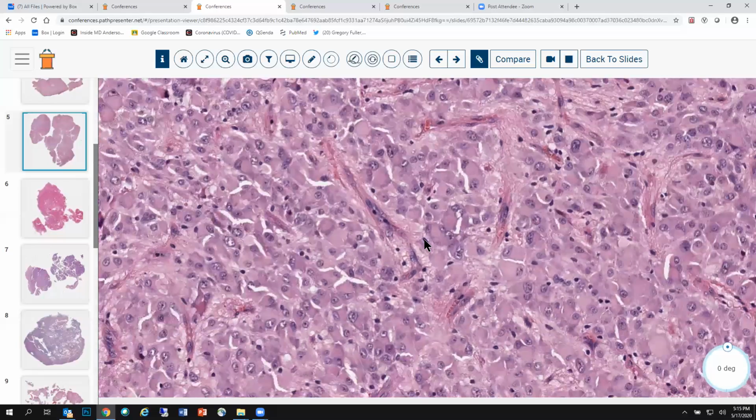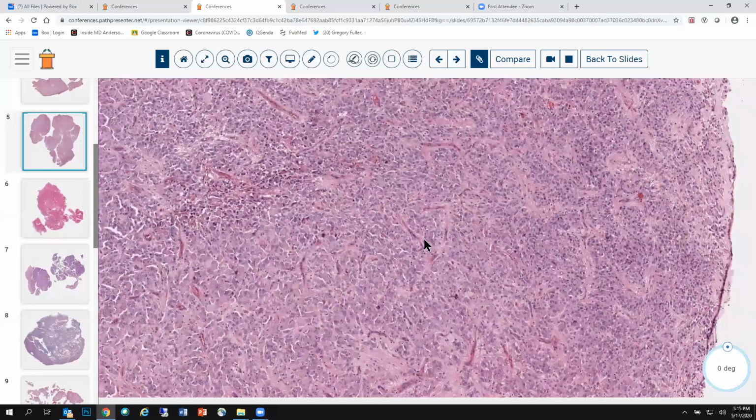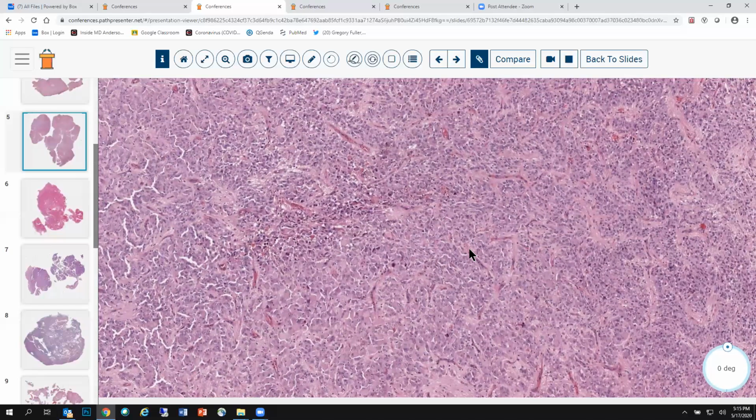Now, if you look at this tumor, just the histology first, and it is screaming to you, I bet this is a SEGA, then you can see in your mind, you're actually seeing the pre-op imaging. You're seeing an intraventricular tumor, most commonly in the lateral ventricle. That's why I say that pathology is imaging. Imaging is pathology. It is so powerful. All right, classic SEGA. All you have to do is think about it. And if you think about it in the differential, you look at the pre-op imaging, etc.